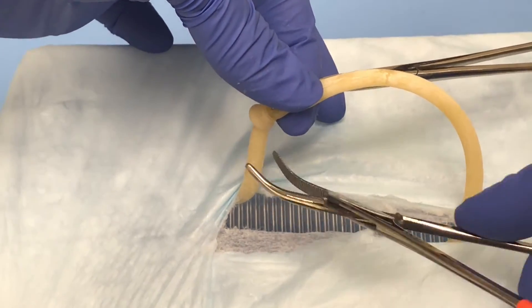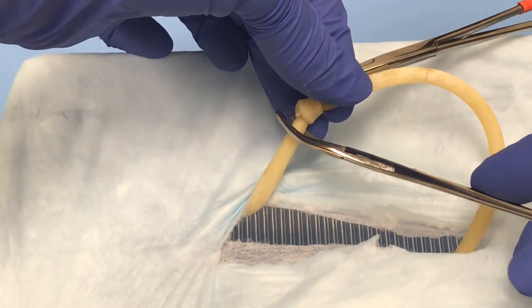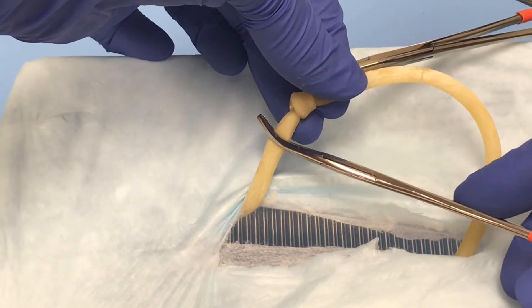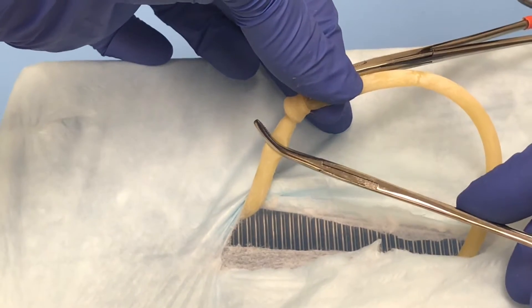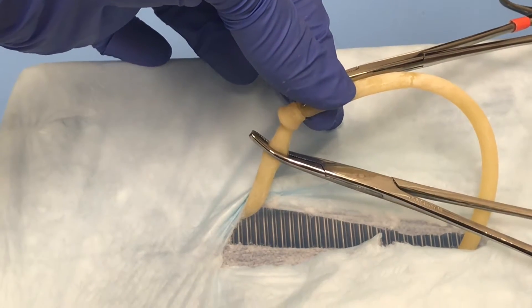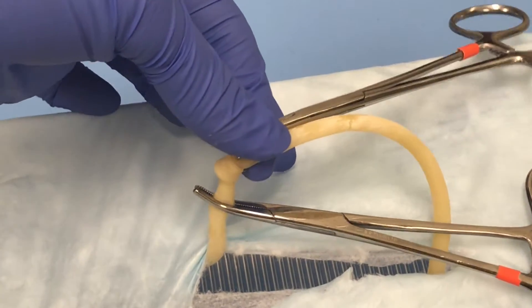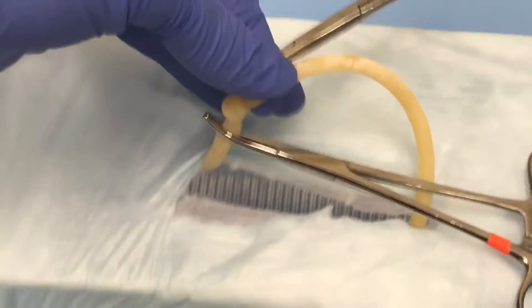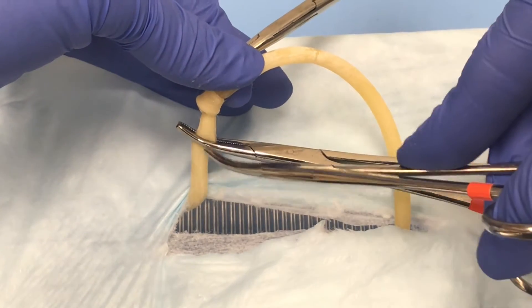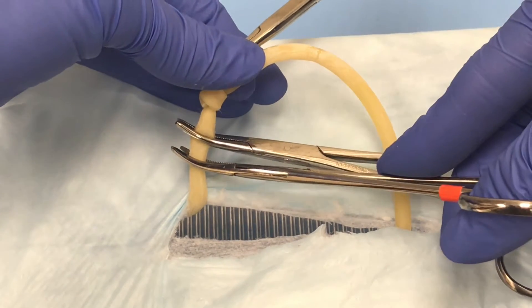From there you're going to place your clamps. Your tips should always be up and pointing out of the abdomen. Your first clamp, closest to the ovary, should be at least five millimeters away from the ovary, and make sure you don't have any other tissue included in that clamp — no intestine, no mesentery, no omentum, and no body wall. Your second clamp will be placed about five millimeters proximal, because proximal is going to be closer to where your blood supply is coming off to that ovary, further toward the body wall.